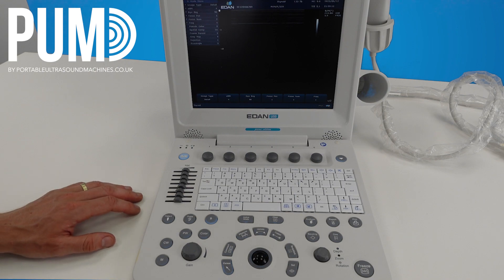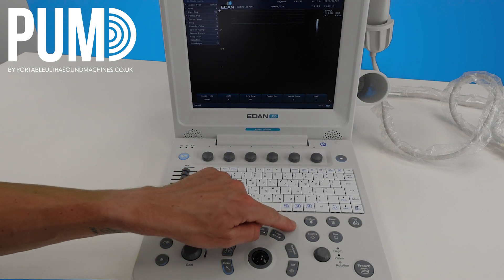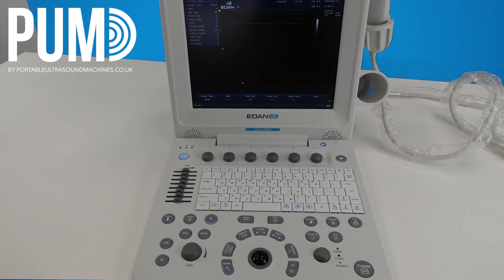If you're happy with your scan and you think you've got everything you need, you can just hit the end exam button. This was just a quick guide on how to use the EDAN U50 system. Once again, not a system we stock ourselves, but we did get one in so we thought we'd create a video. If you have any questions please do get in touch — there's a lot of stuff we haven't covered in this video, so any specific questions just let us know and we can help you out.